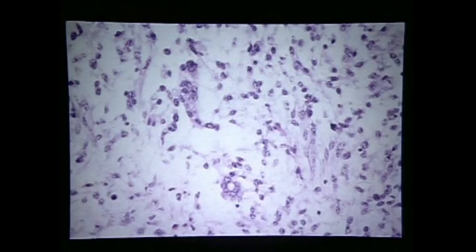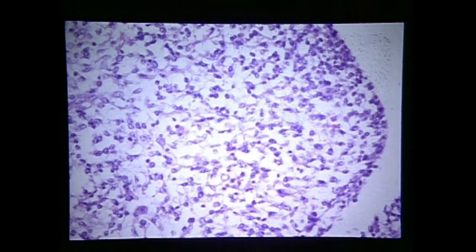Here a little bit more cellular and hypercellular configuration of these cells. Here a little more loose a configuration with a very mild fluid in these empty spaces. And somewhat along in some areas it either reached or arose from what appears to be a mesothelial surface.